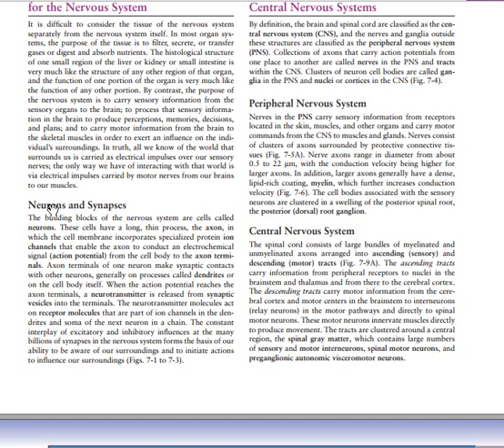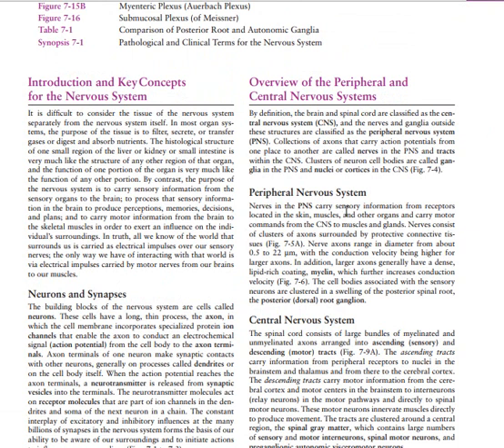So we are going to visualize a neuron and the synapses. We have said that the neuron is involved with the transfer of action potentials, because there are different channels at the level of the neurons which are involved with that. Now we also have synapses. We are going to visualize the histologic section of synapses later.